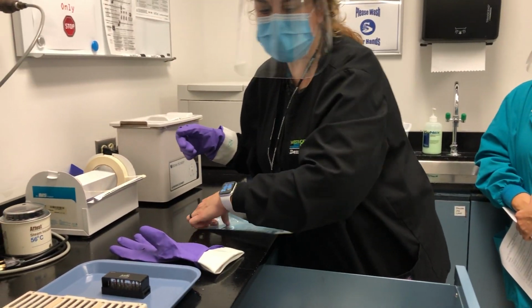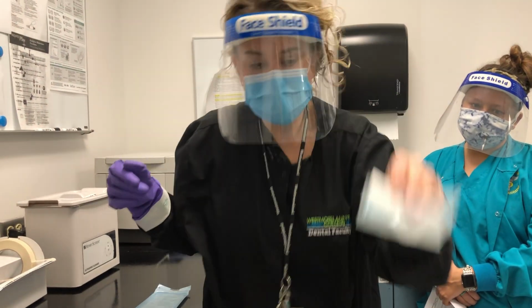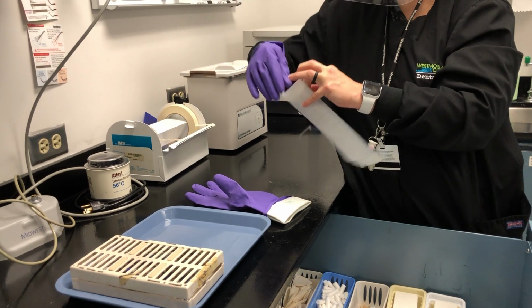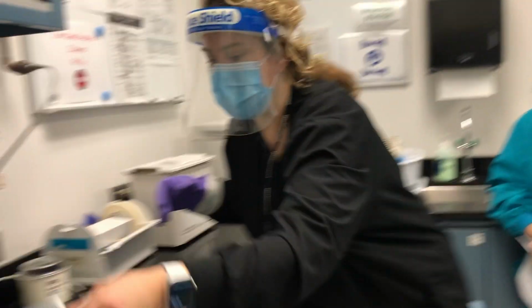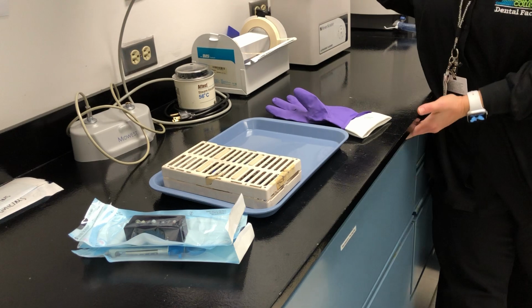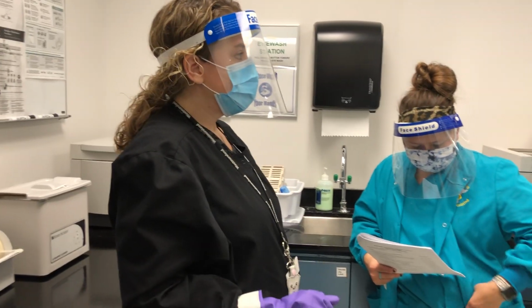This burr block is just a little bit too big, but we do have little ones that normally fit our burr blocks, okay? This burr block is unfortunately just a little too big, so we're going to practice with a bigger one. And same thing, you're just going to hold it open and slide it down in and just fold it over, okay? So those are our packaged items. In the office that you work in, what you saw was the large amalgam cassettes of our instruments you're identifying.